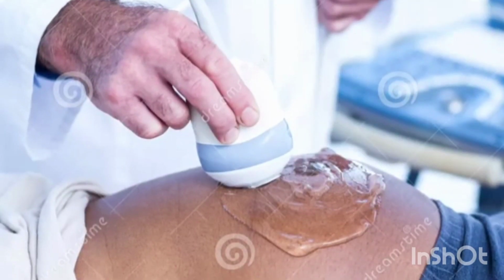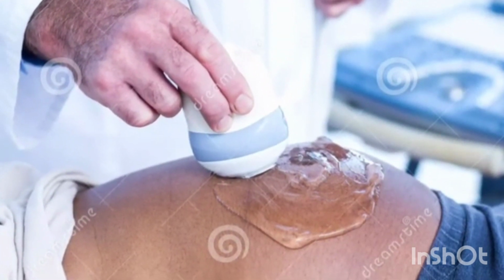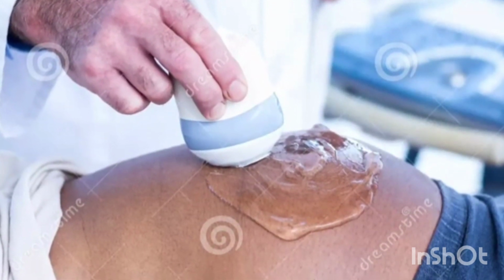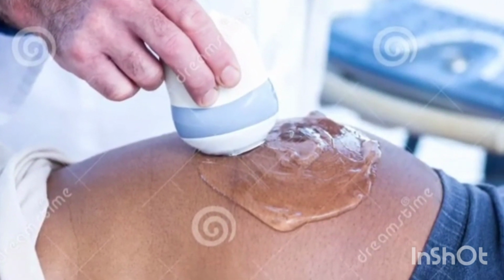The initial portion of the exam is performed with a transducer on the abdomen. Conducting gel is placed on the skin, which feels wet and cool. The transducer is moved around as the technologist takes pictures of the uterus and ovaries.